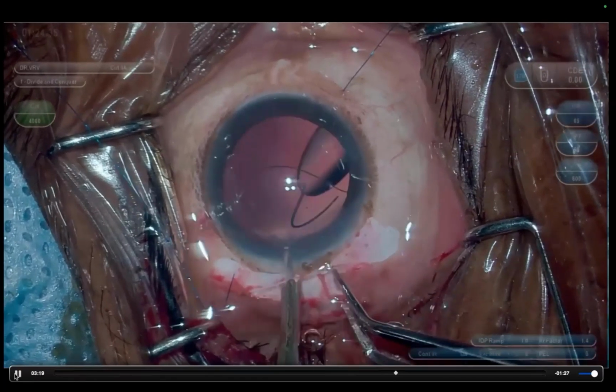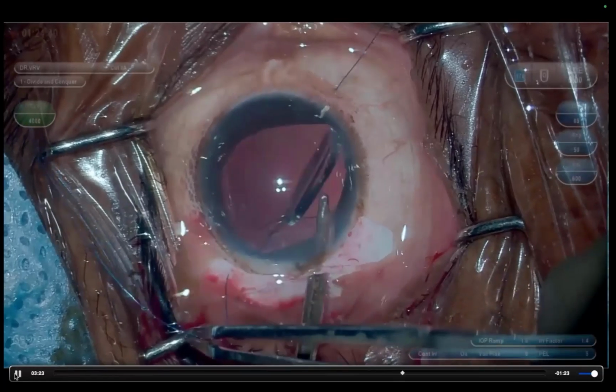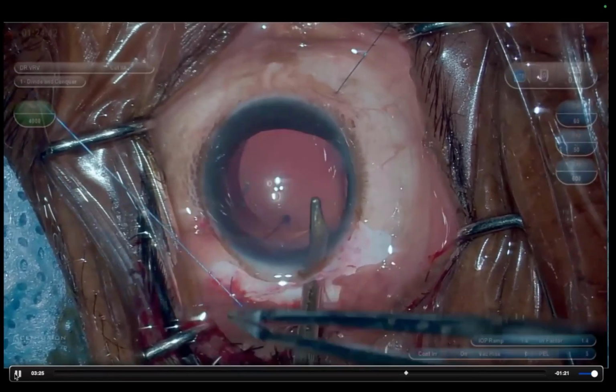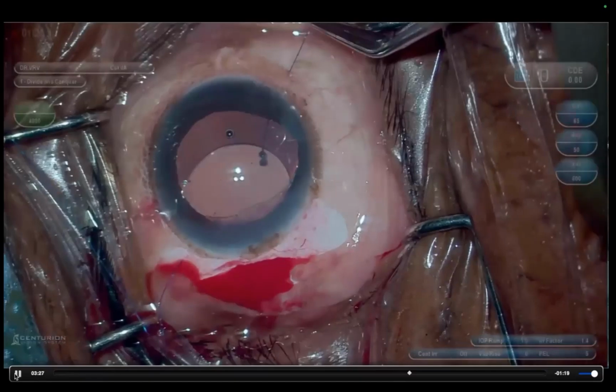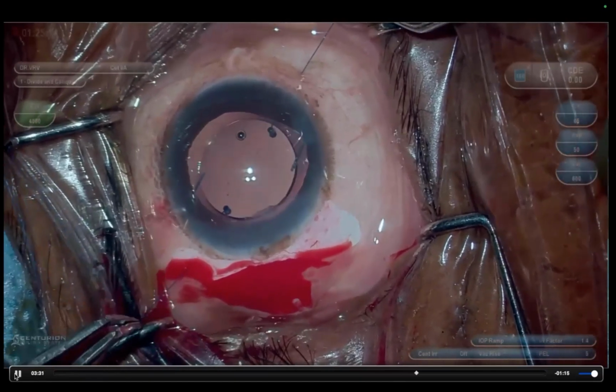Because even if it goes, all you have to do is pull the suture through the sclerotomy like how you see in this video, and then the IOL will come back to position. Okay, so relatively very simple procedure, just 1 or 2 cases and the learning is complete.